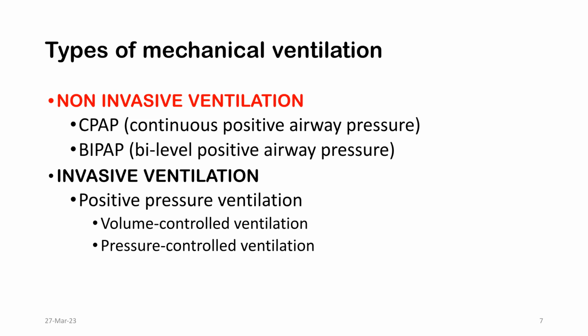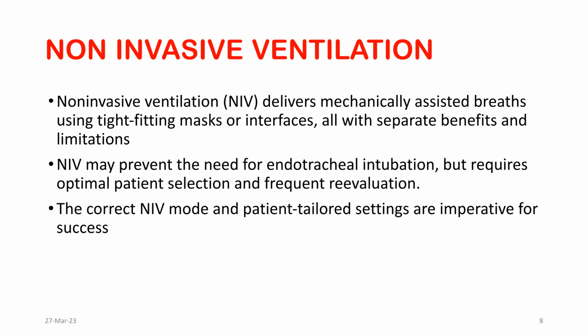Types of mechanical ventilation include non-invasive ventilation, such as CPAP and BiPAP, and invasive ventilation, like positive pressure ventilation. Non-invasive ventilation delivers mechanically assisted breaths using tight-fitting masks. It may prevent the need for intubation, but requires optimal patient selection and frequent reevaluation.